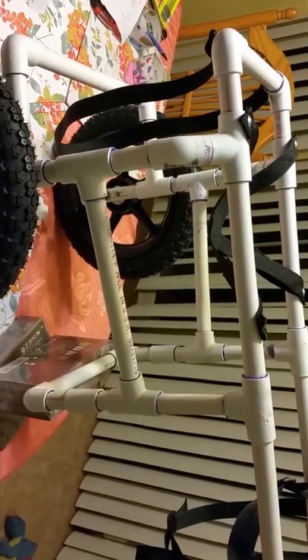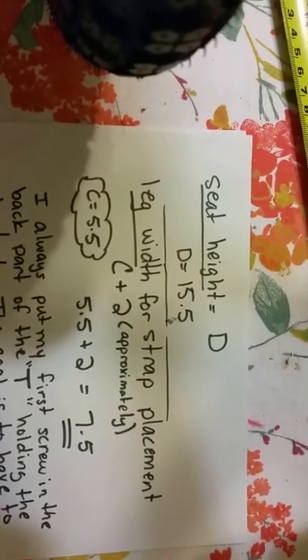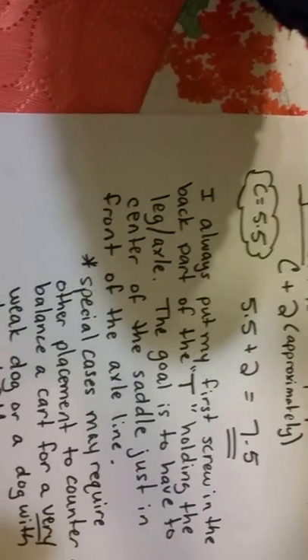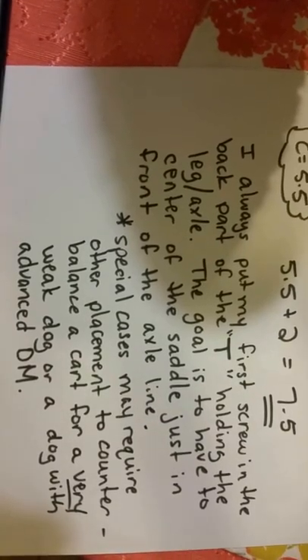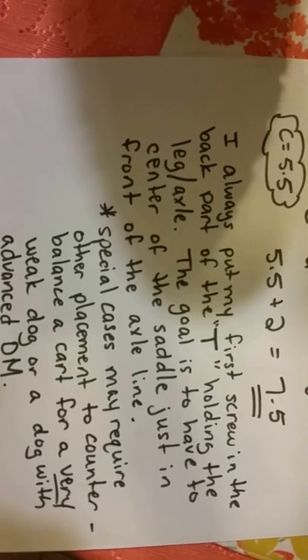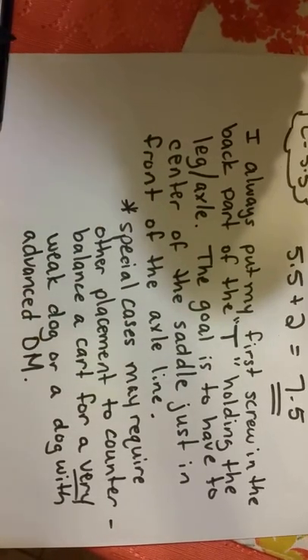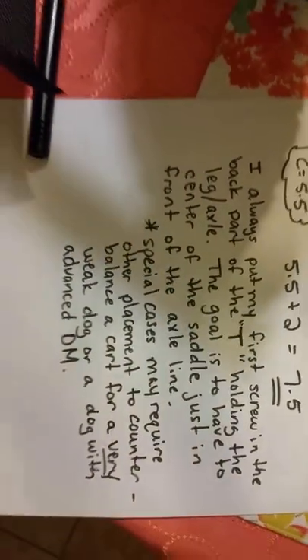Here's our cart — we've installed the straps. This dog needs a 15 and a half inch seat height, and we always start for the saddle by putting the first screw in the back of the tee on the leg holding the wheel. This makes it so that the center of the saddle sits in front of the axle.